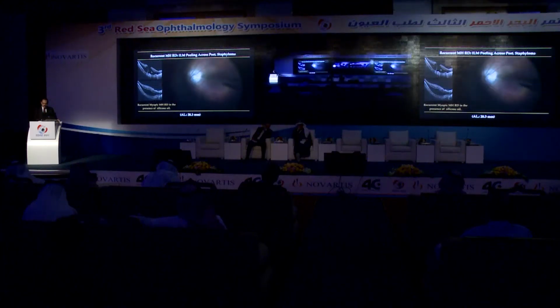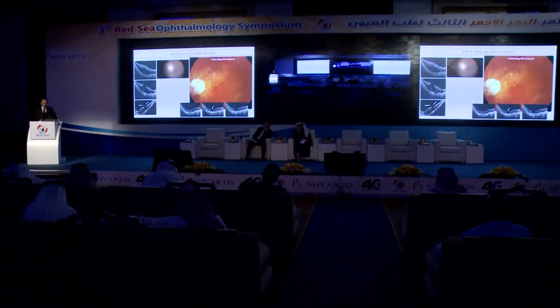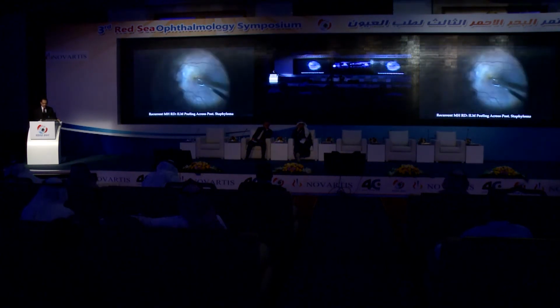The internal limiting membrane was removed, starting with the Tano scraper, creating an edge, and then the internal limiting membrane was removed to the edge of the staphyloma as done before. Again, the retina was attached even after removal of the silicone oil, but the macular hole remained open. So again, something is missing. The same here, and also the macular hole remained open, although the retina is attached and the patient experienced improvement in his visual acuity. So what is missing is the inverted flap.